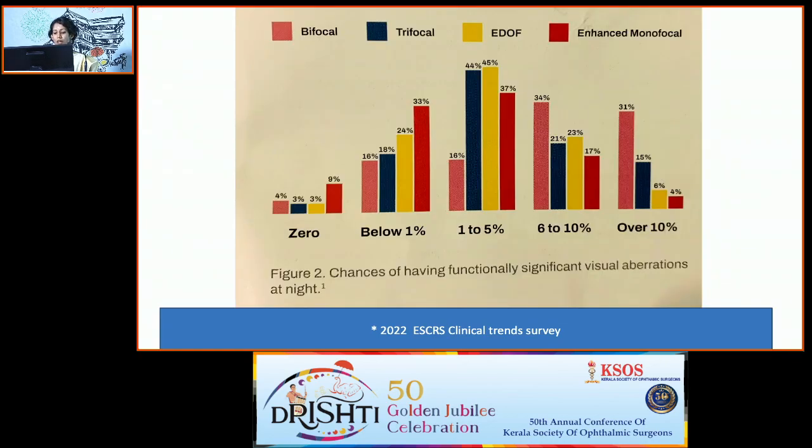Visual aberrations are high with the conventional bifocals and lesser with the newer lenses, that is the extended depth of focus and the trifocal lenses.